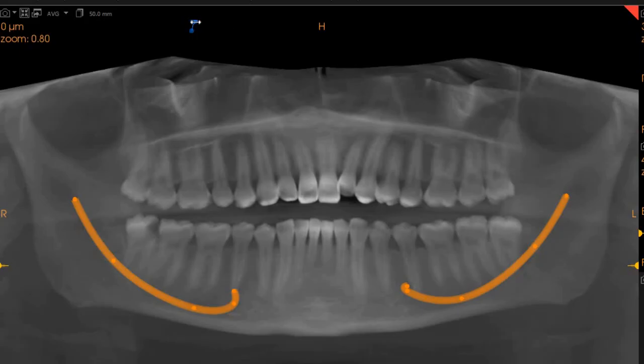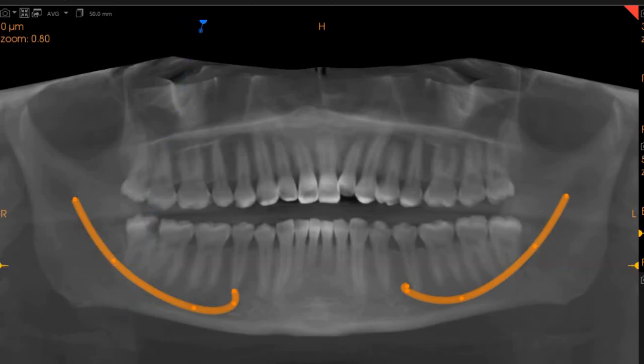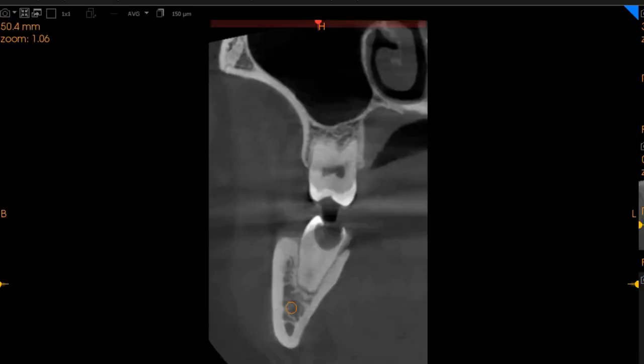This is the CBCT of the patient that she had requested. The area of interest is the lower right position of the tooth and its association with the inferior alveolar nerve for the surgical extraction.